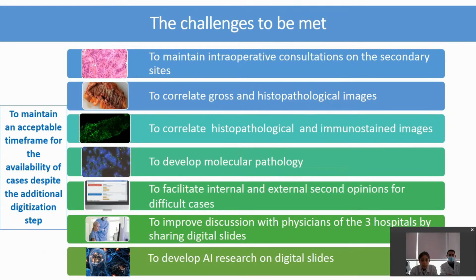The challenges we had to meet in this context of reorganization and rapid evolution of pathology were numerous and were largely overcome thanks to the parallel implementation of digital pathology: to maintain intraoperative consultations on the secondary site, to correlate gross and histopathological images, as well as histopathological and immunostain images, to develop molecular pathology, to facilitate internal and external second opinions for difficult cases, to improve discussion with physicians of the 3 hospitals by sharing digital slides, and to develop artificial intelligence research on digital slides.